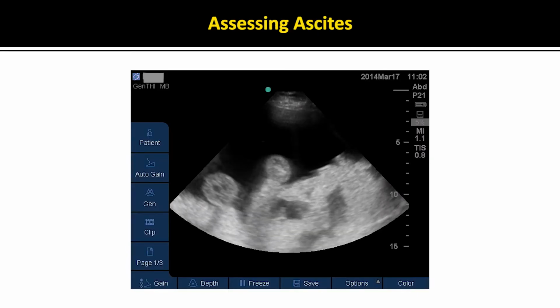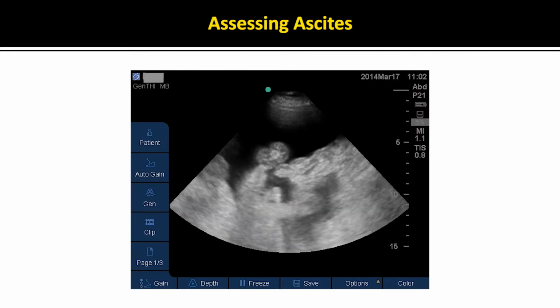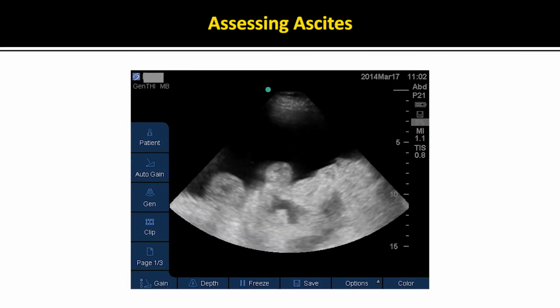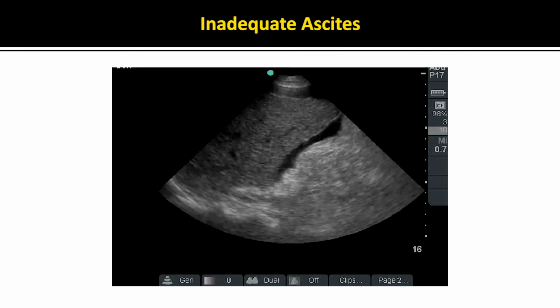When present, ascites appears as anechoic fluid with bowel floating in it. It is important to press and visualize bowel behind the ascites, and make sure that this is not a dilated, fluid-filled loop of bowel or bladder, rather than a pocket of ascites. Ascites that is localized to areas near visceral organs, or not large enough to be assessed safely at the bedside, should be sent to radiology.